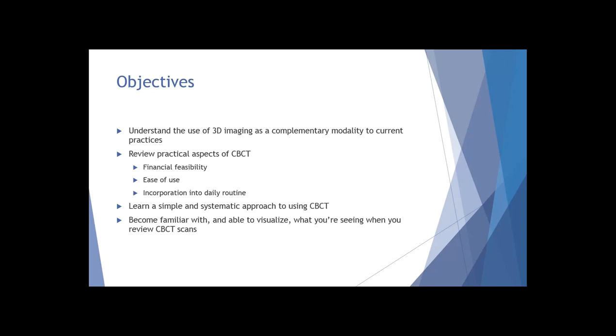I want to go through a simple systematic approach to how I review scans, and I'm hoping that everyone has the opportunity to start to visualize what you're seeing when reviewing CBCT scans. As with anything, you don't want to offer the diagnostic modality to people when you're not sure what you're doing with the results. It takes a little bit of time to become familiar with CT, and there is certainly a learning curve. The hope is that you can at least become familiar with what you see on screen.